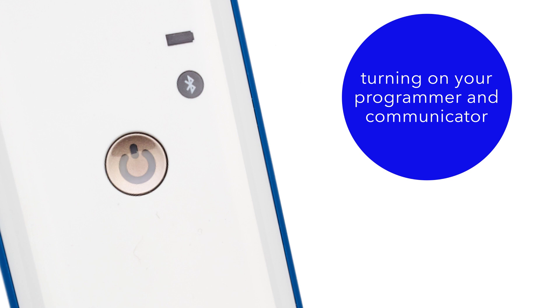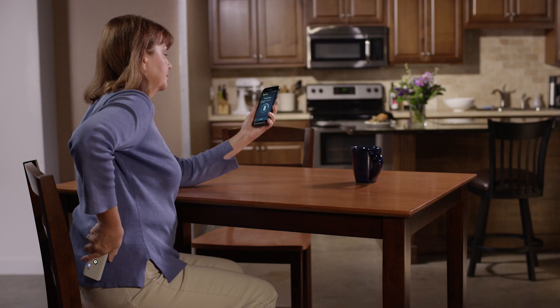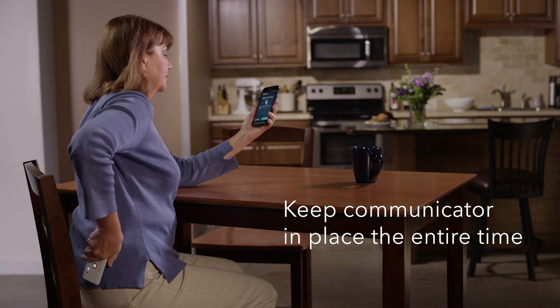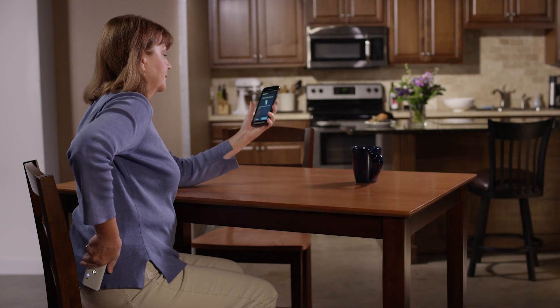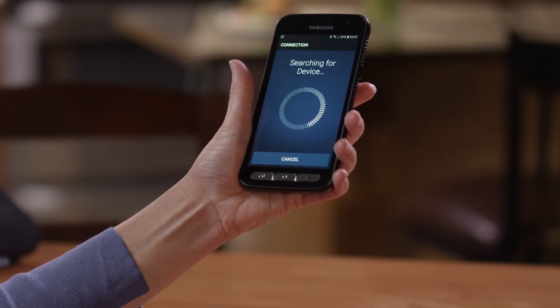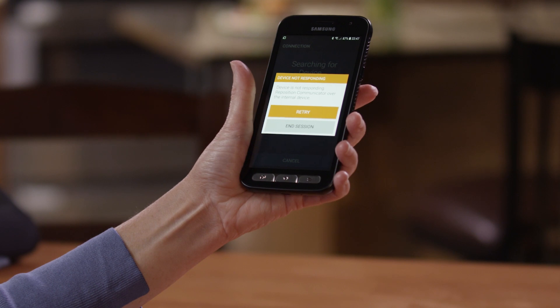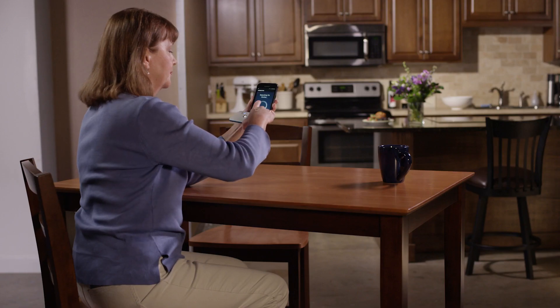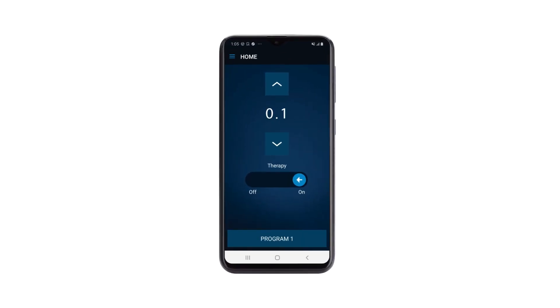Next, place your communicator, blue side down, over the implanted neurostimulator site. On your Programmer, tap Find Device. If "device not responding" appears, reposition your communicator and tap Try Again. It may be helpful to tuck the communicator in your pocket. When connection is successful, you will see this screen.